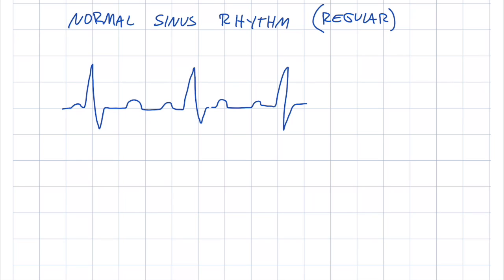Sure, heart rate may increase or decrease a little bit, but not from one heartbeat to the next—it will be a slow ramp up. Use your best judgment in understanding what equal distance between identical waves means. Remember that all the automaticity foci that can take over when the sinoatrial node no longer conducts normally also have a regular rhythm. So finding a regular rhythm doesn't mean your search is over.